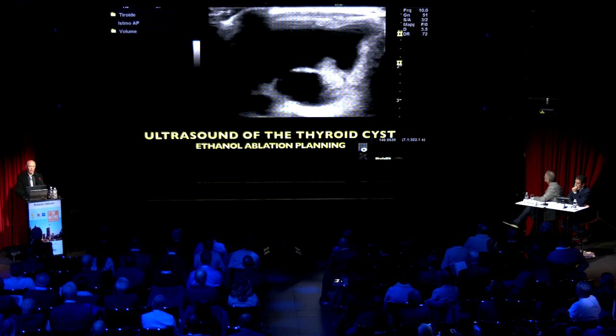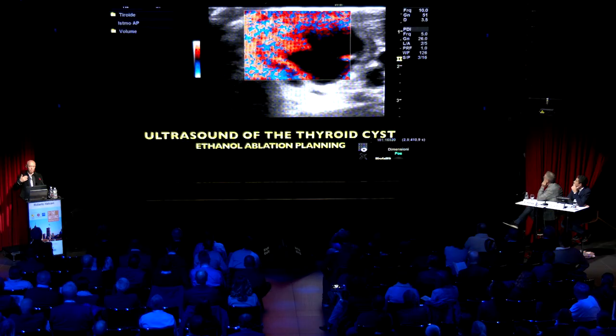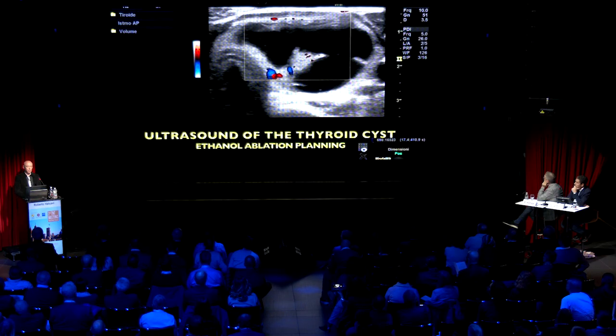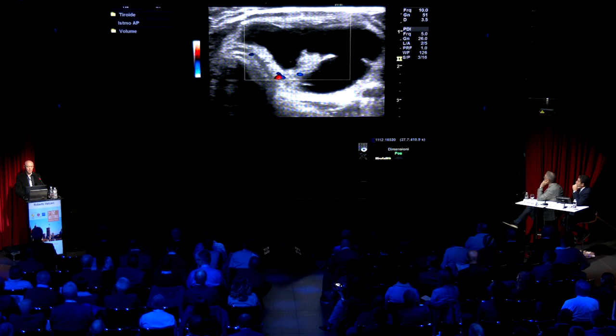The image is overturned. It is the same image of the right lobe. It seems a left lobe, because I sat behind the patient, and I found that this is the most comfortable position, provided that you have the ultrasound monitor and the repeating monitor in front of you. And this is the position that I prefer for all interventional maneuvers. And I will show you later the exact position.